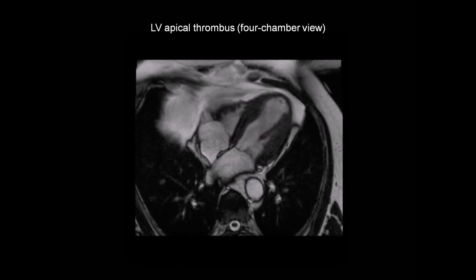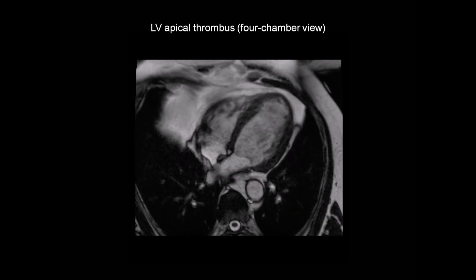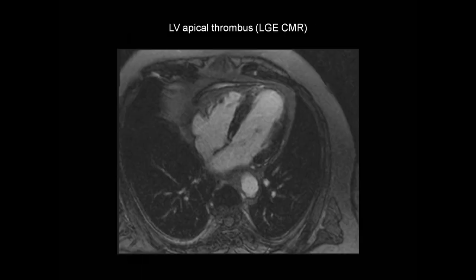It's a little hard to say in this view whether there's a thrombus — there's a little abnormality here, but it's hard to say for certain whether that represents a thrombus or not. So let's take a look at the late gadolinium enhancement image. Looking at the apex, it's not really evident that there's any thrombus there. But this case has been chosen to illustrate the importance of looking at the left ventricle in multiple different views.